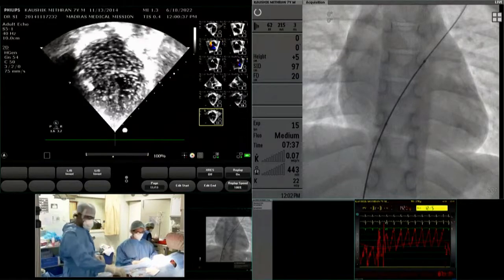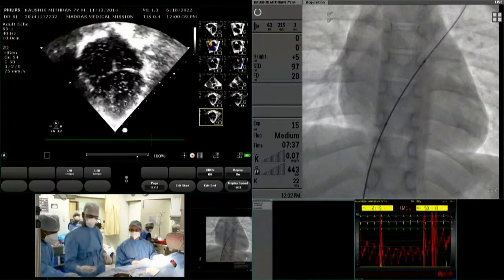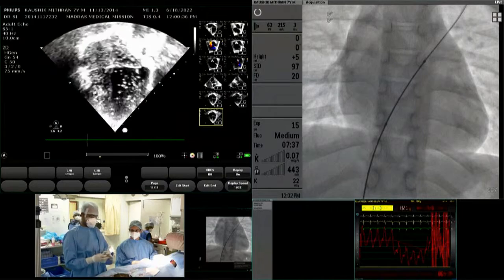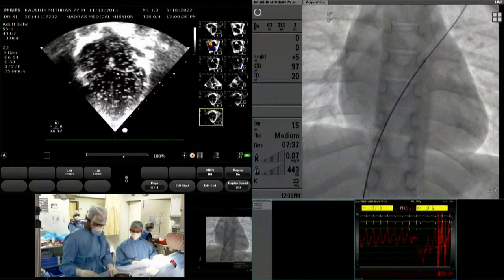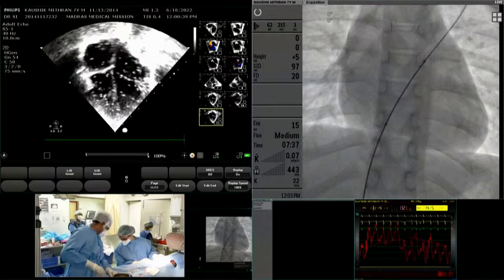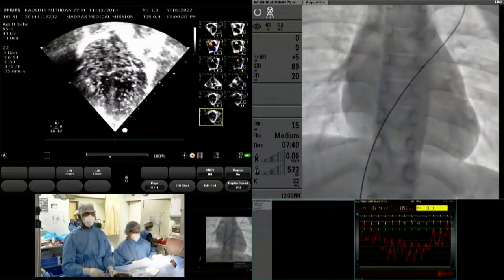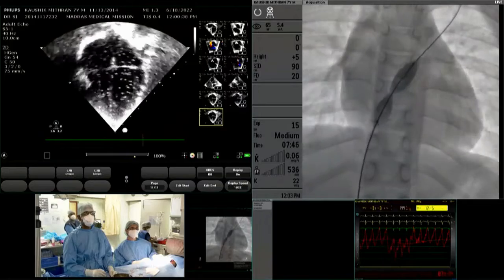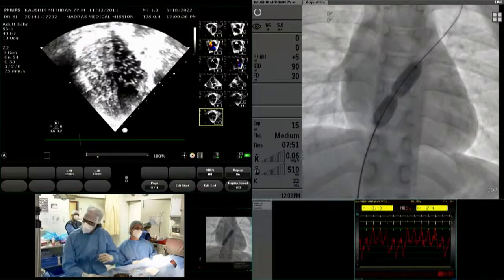The treatment options are interesting here. A baseline cardiac cath, what Dr. Shivakumar is showing: test occlusion, first do the bubble contrast echo, test occlusion, check the RV EDP and all other pressures. If it is a large defect or moderate defect, reduce the size of the ASD either by transcatheter or by surgical method, or offload the right ventricle by doing the Glenn and closing the ASD based on the hemodynamics. So these are all various options, but the most important thing is what he is demonstrating, the hemodynamics are essential.